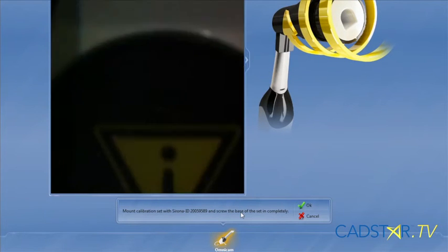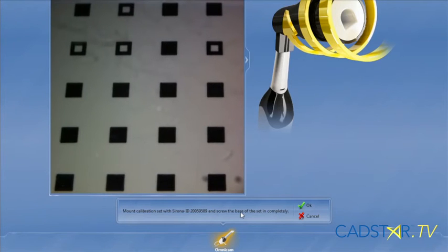This is really important at this time. In the step menu — that's the lower menu on your desktop in this window — you will see an ID number. It's an ID number that needs to match the ID number on your calibration set. Make sure that's in alignment. If it's not, you'll need to give Patterson a friendly call.